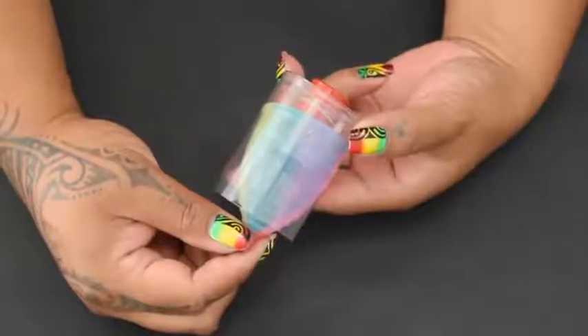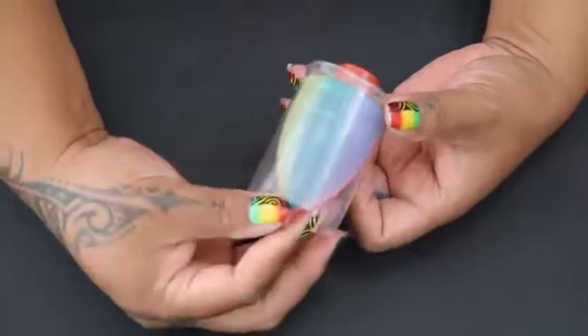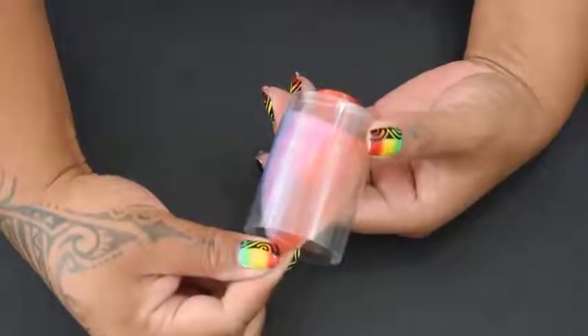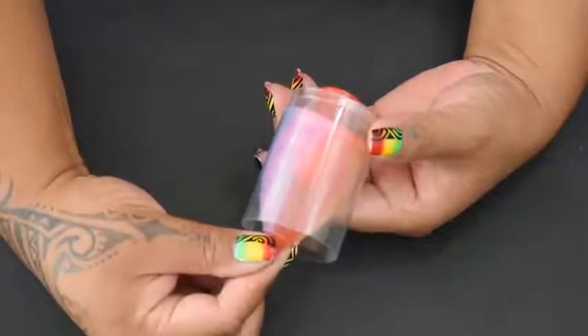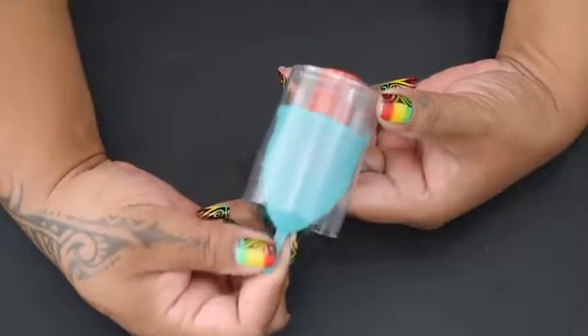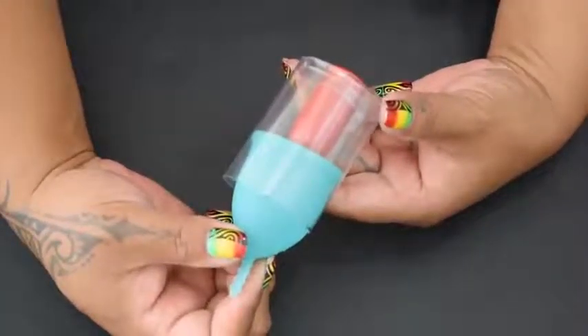Make sure the cup has a good seal. Once your cup is inserted, give it a gentle tug. If there is any resistance, chances are it does have a good seal. However, if your cup slides easily, it probably isn't placed correctly and you'll want to reinsert it.